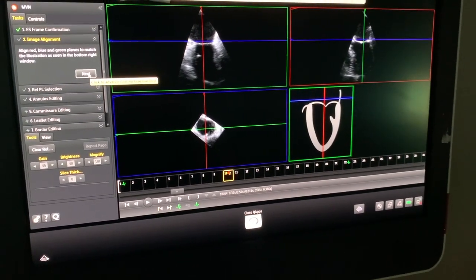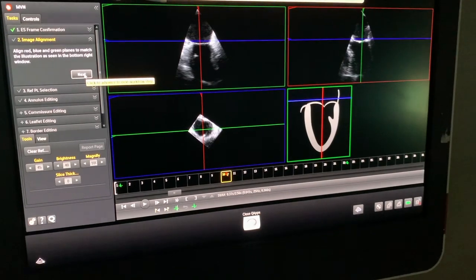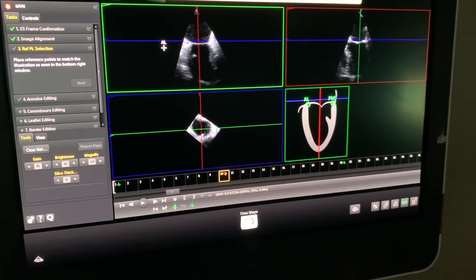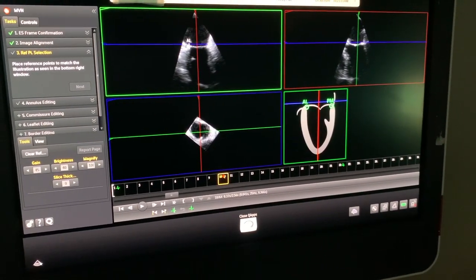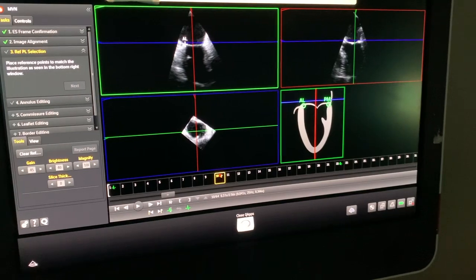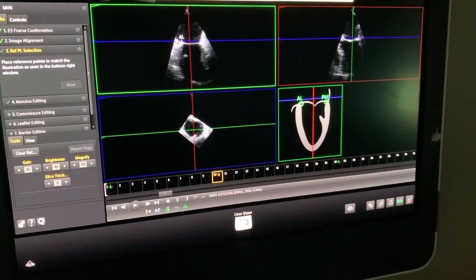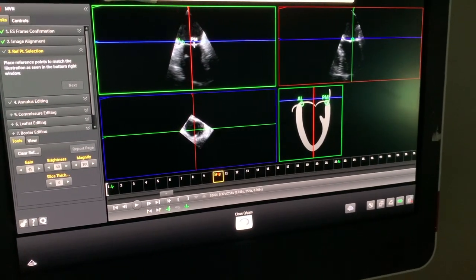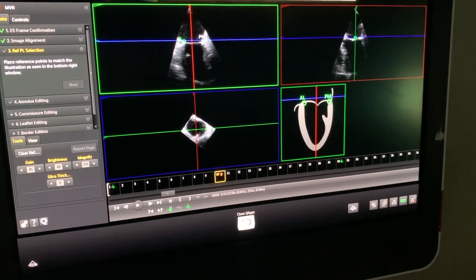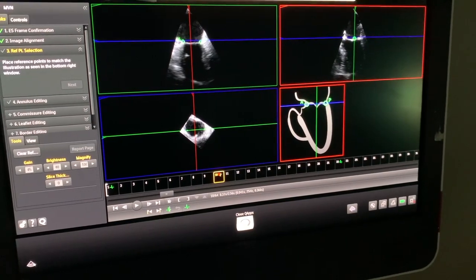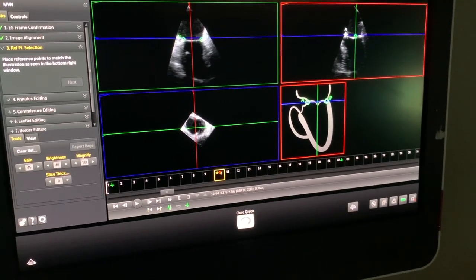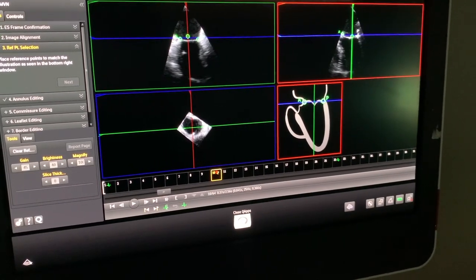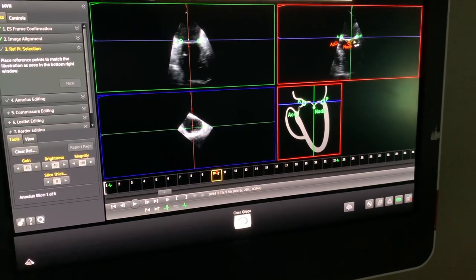Subsequently, we just click Next, which will bring us to the markers. We put the anterolateral marker here, and the posterior medial marker there. You can see the right lower quadrant tells you exactly what marker to put, so you won't make a mistake.